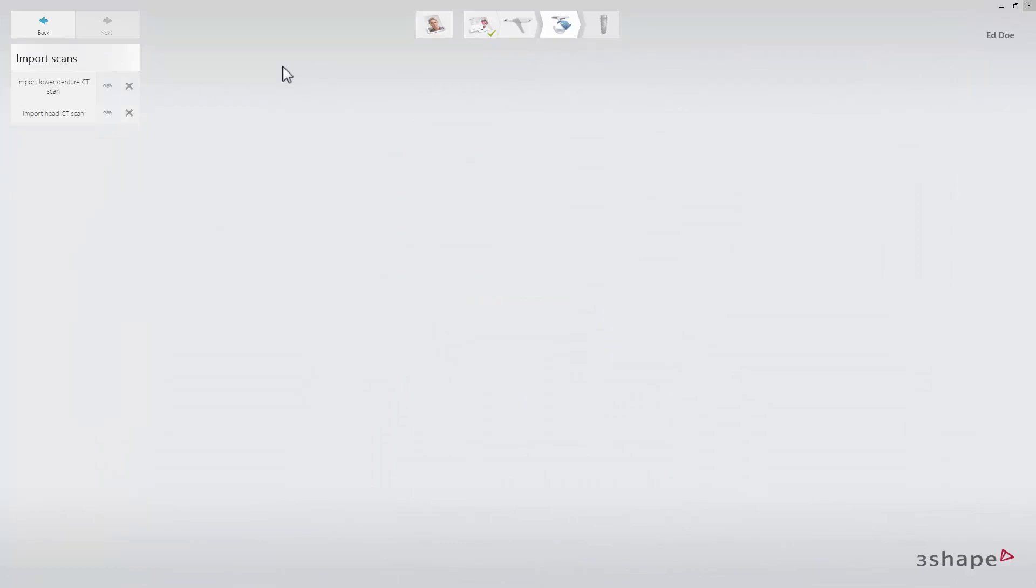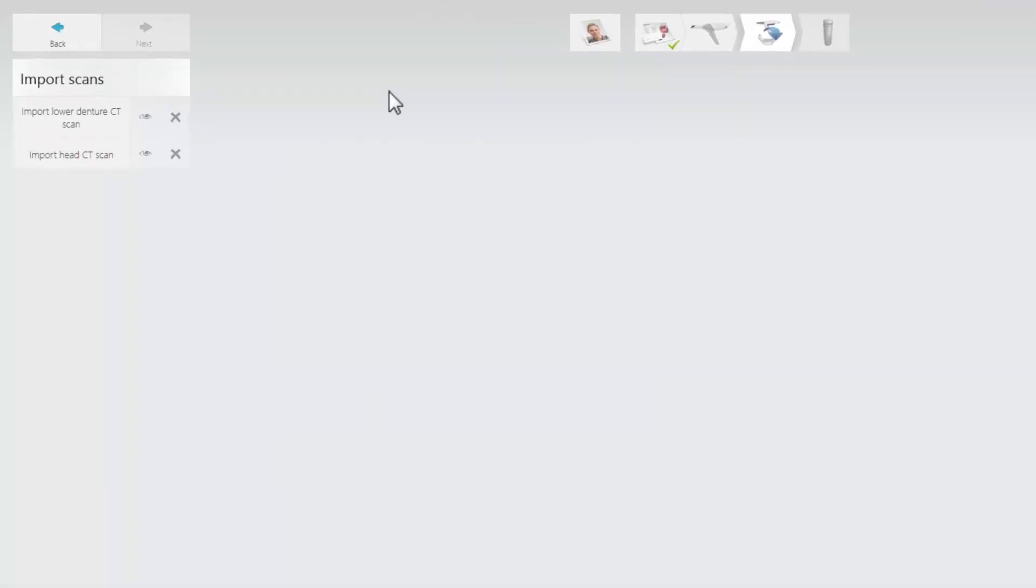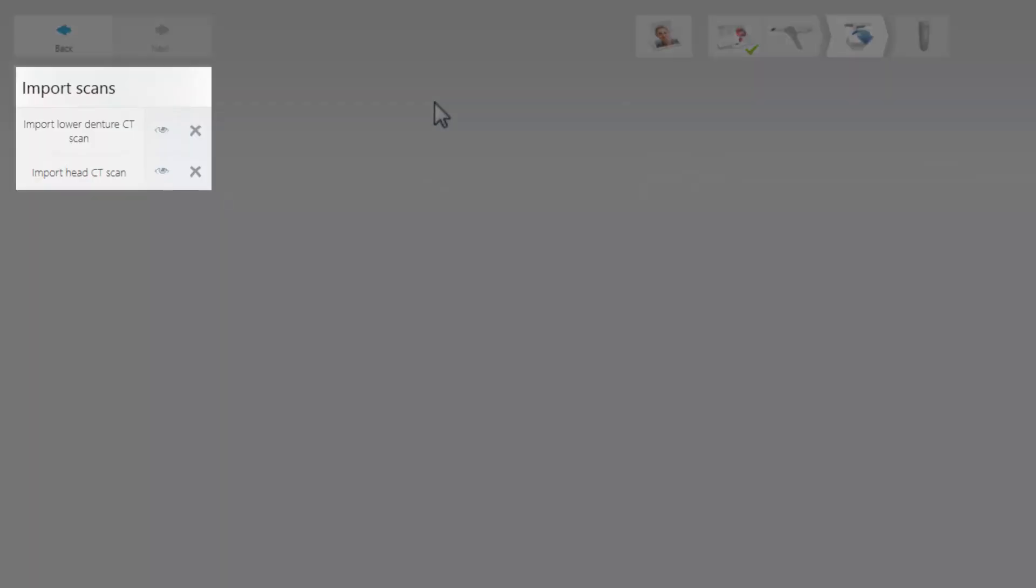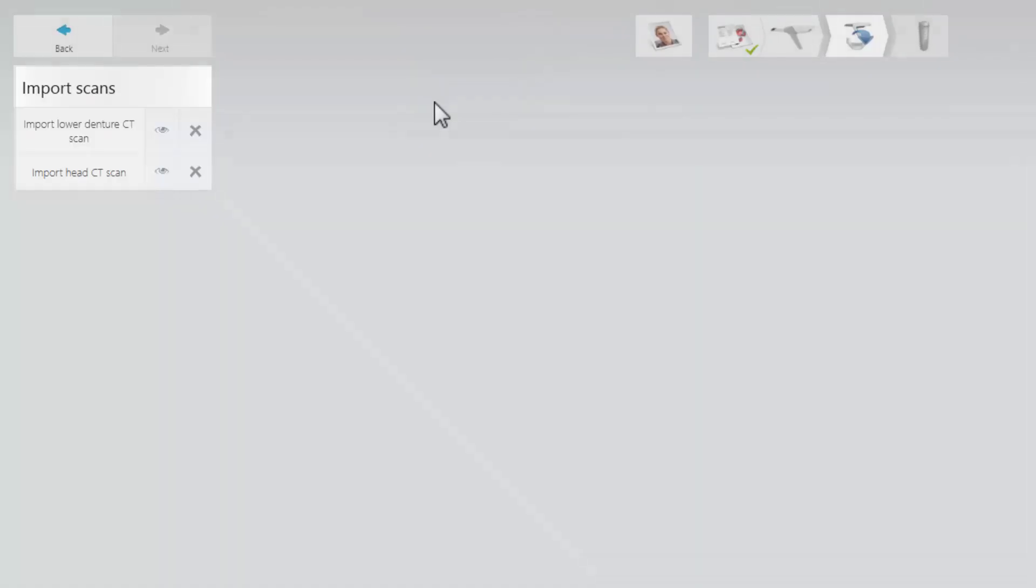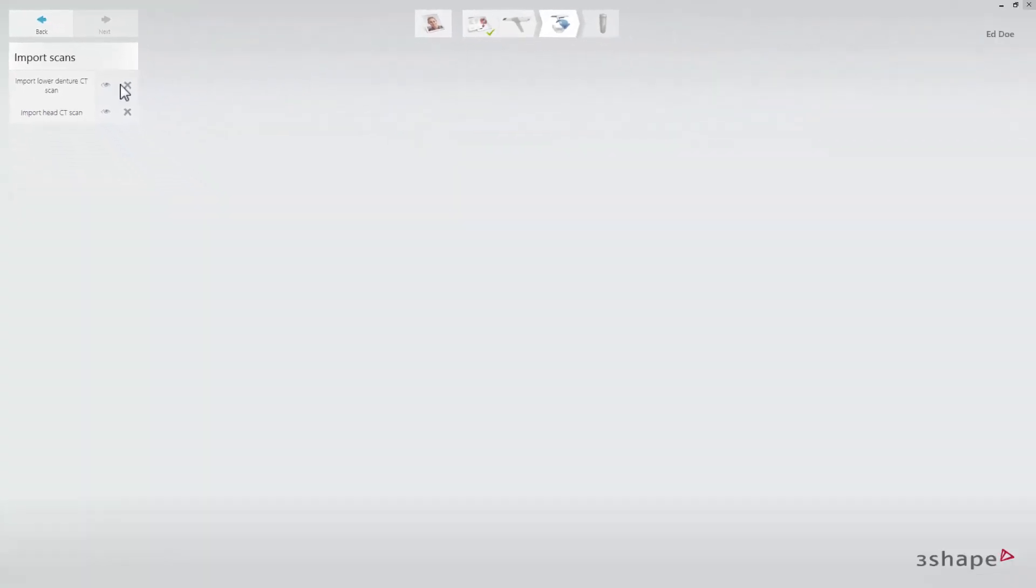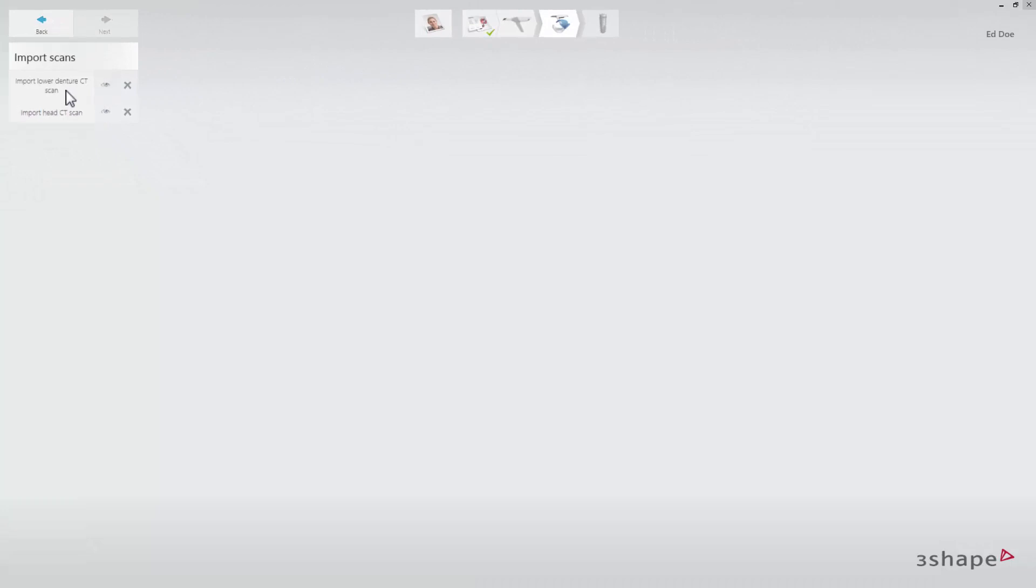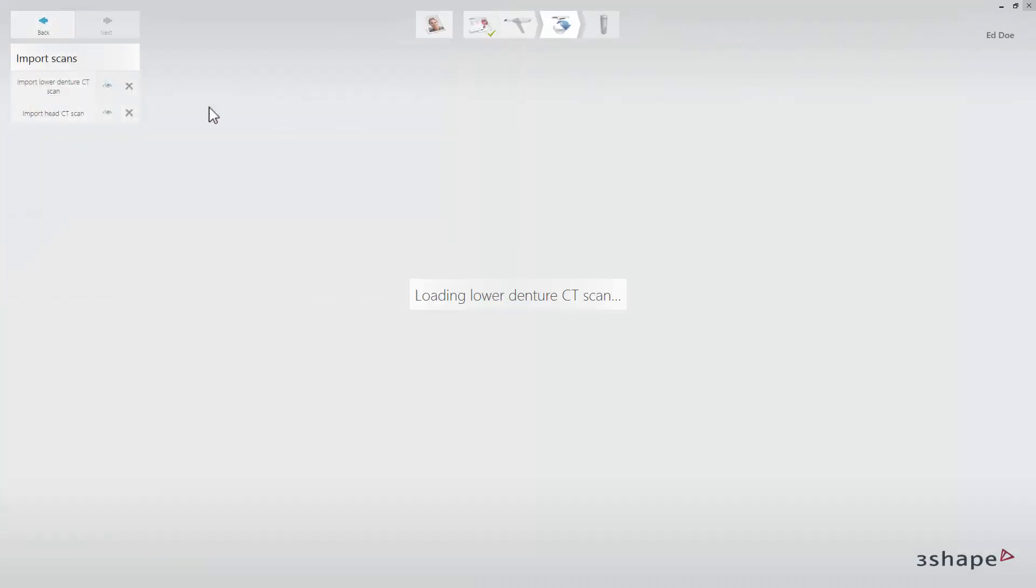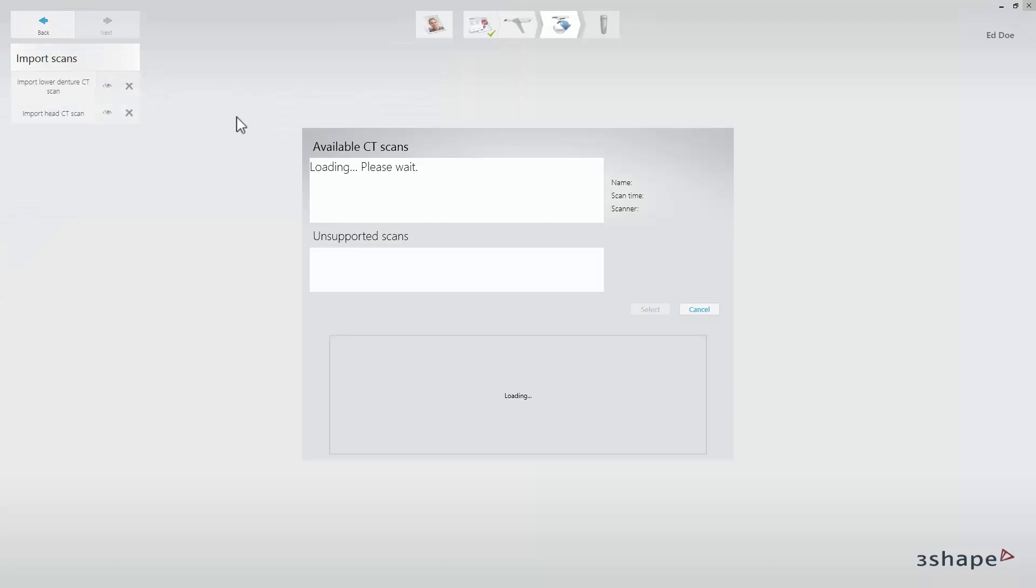The import scan page allows you to load CBCT CT DICOM files. In this example, we will use only a lower denture scan and a head CT scan. Click the import lower denture CT scan button and browse to find the correct DICOM file. You can preview it in the pop-up window.